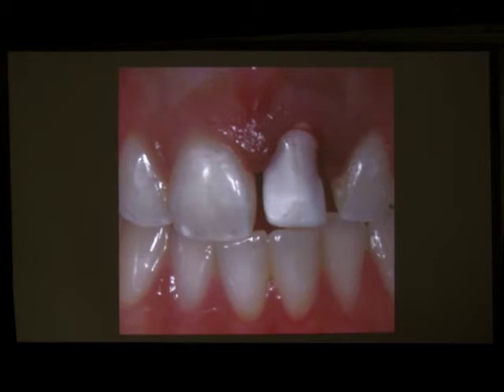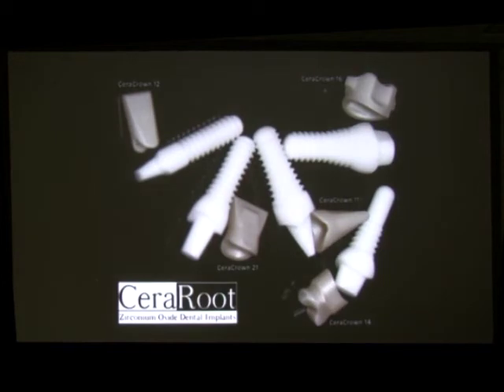In the back, when we have implants that are not aligned, sometimes you have an implant with not so much torque, and you cannot go deeper because you have the nerve, and you cannot unscrew, because if you unscrew you lose stability. So sometimes where the implant stops, it's where we restore, and we don't care about the margin because we make a new preparation. So in the front, if you have drilled through the incisal edge and your direction is correct, and it's an immediate extraction, it's not difficult, it's time to go 180.